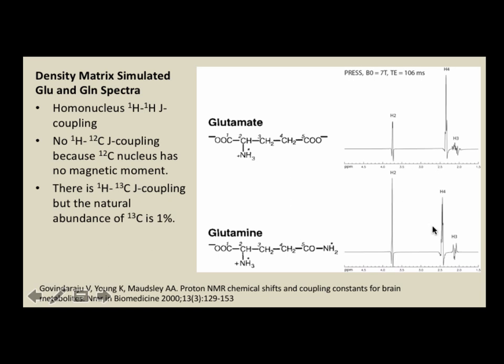And the glutamine H4 peaks are at 2.45 ppm. They are separated by 0.1 ppm. They can be separated at 7T but not at 3T or 1.5T, because at 7T the resonant frequency is higher, so they have more separation.